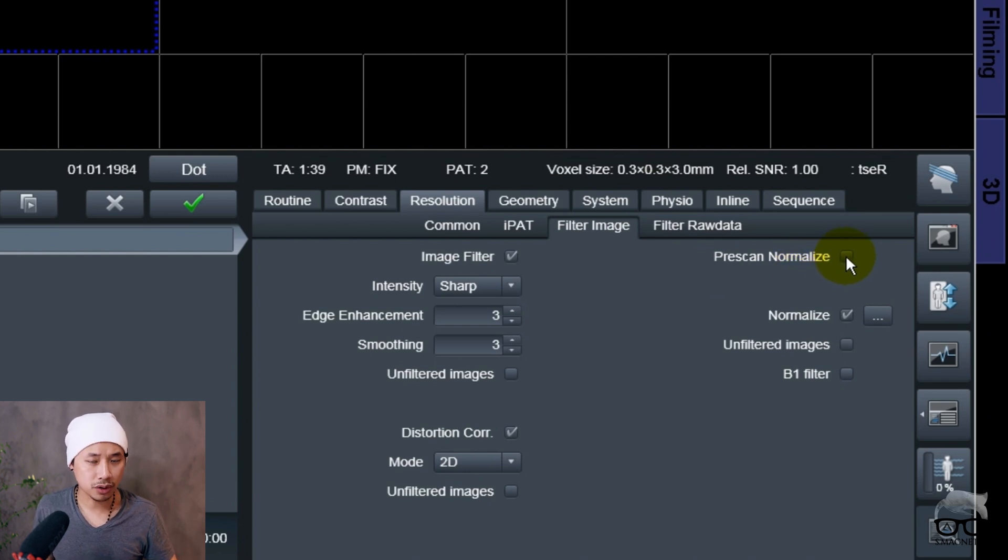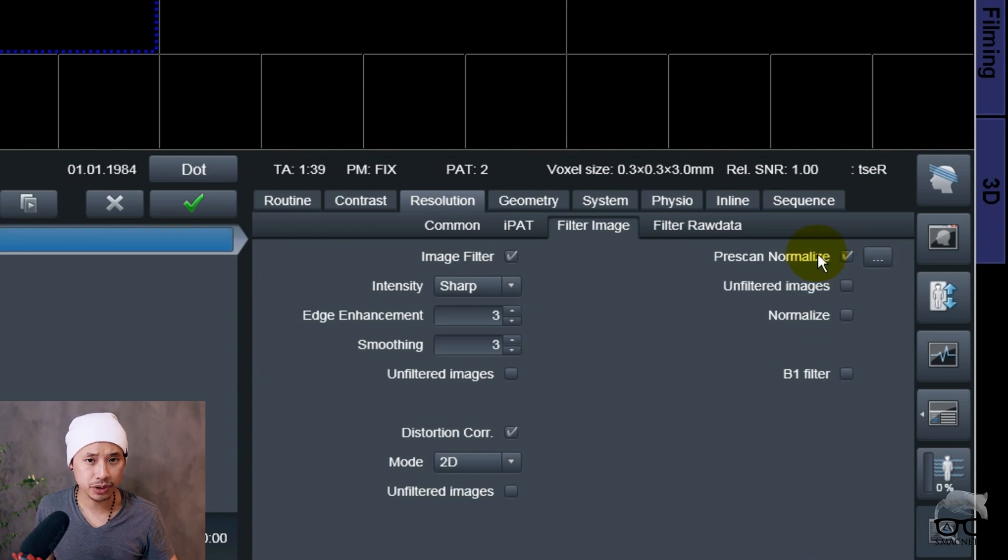Inside Resolution, Filter, Image - pre-scan normalize automatically turns off like I told you. It detects another coil. It needs to be on always, whether you are 1.5 Tesla or 3 Tesla. It doesn't matter, it should be on.